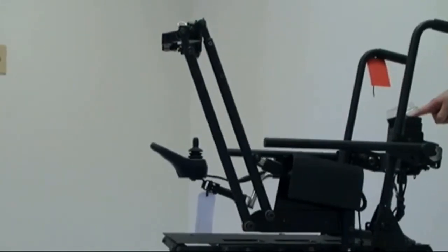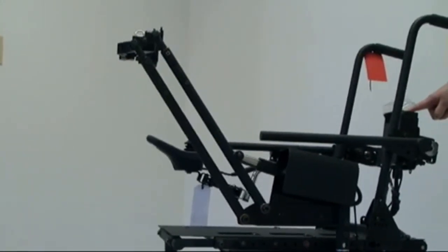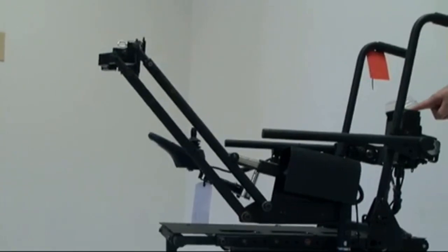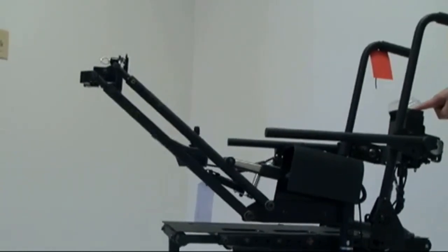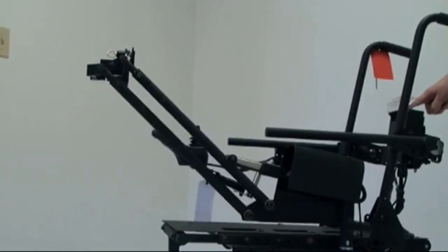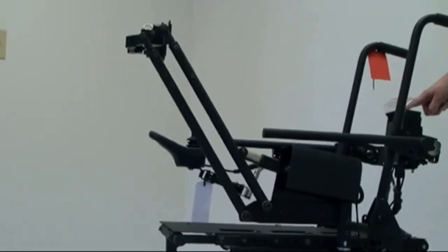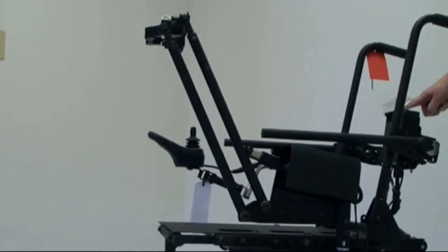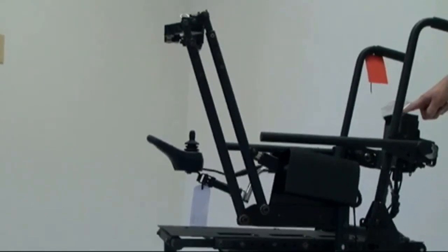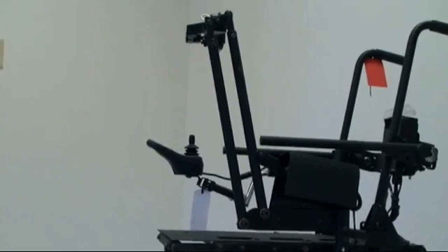And this is the Motion Concepts option. You can see it moving forward. There is a version, I'm not sure if it's on this one, that also, yeah, it's not on this version. They've changed this several times. They haven't sold a lot of these, and they keep redesigning it, but it is possible to tilt the angle of the device as well, so the client can flatten it, make it more parallel to the floor for getting it out of their line of sight.